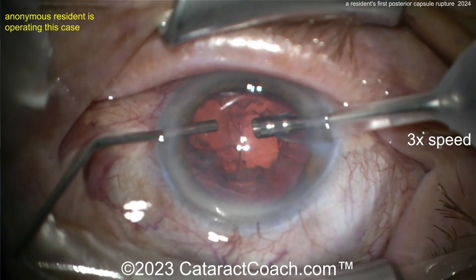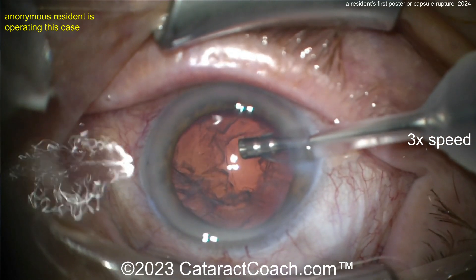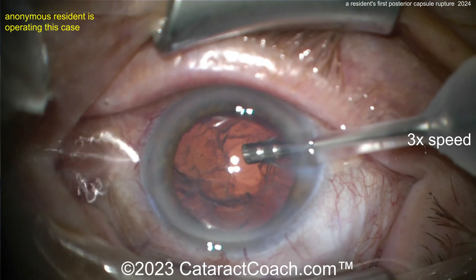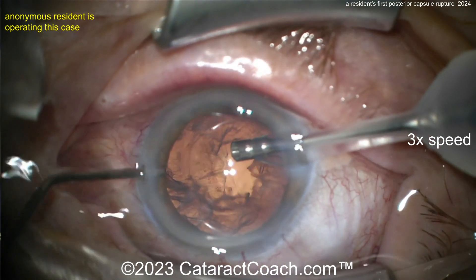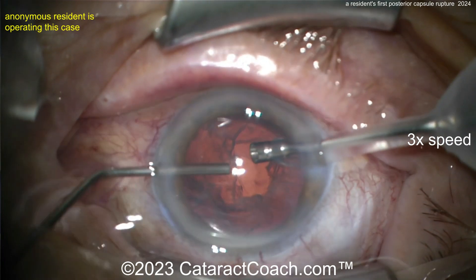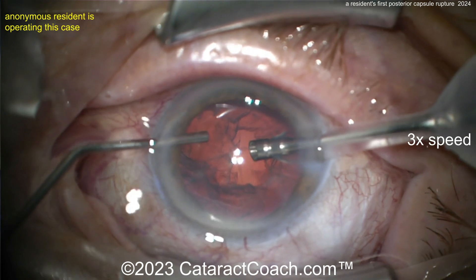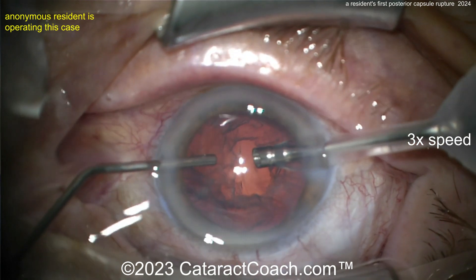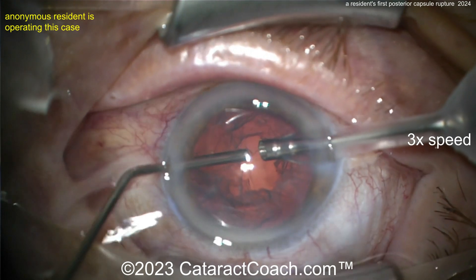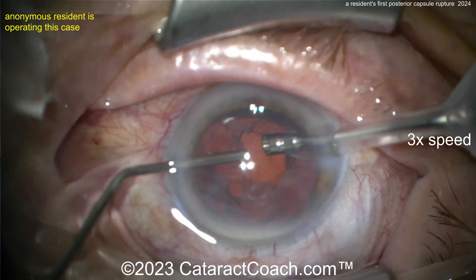Once the viscoelastic is injected, come out of the eye. Remember there are two different machine settings you'll use depending on how much vitreous prolapse you have. Keep injecting a little viscoelastic, then come off the pedal completely — you'll have no more infusion, because that infusion will just keep washing out all your viscoelastic.